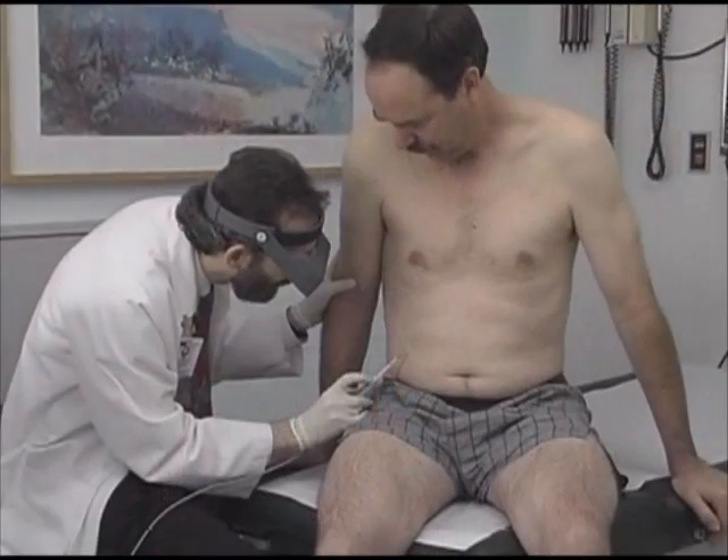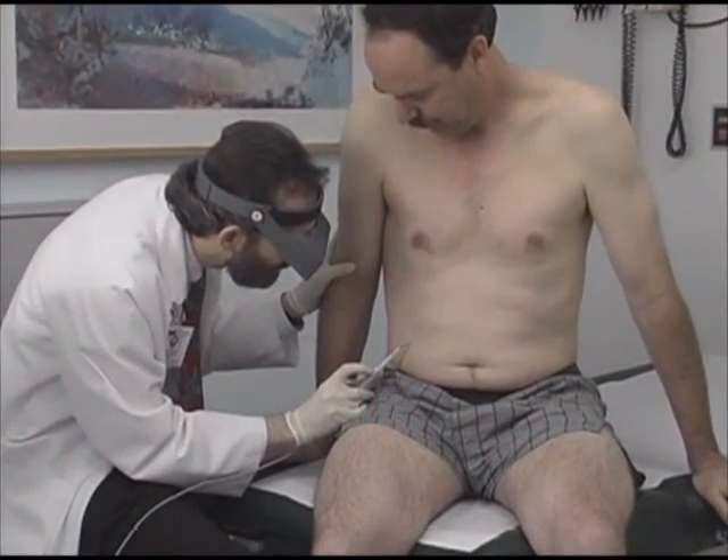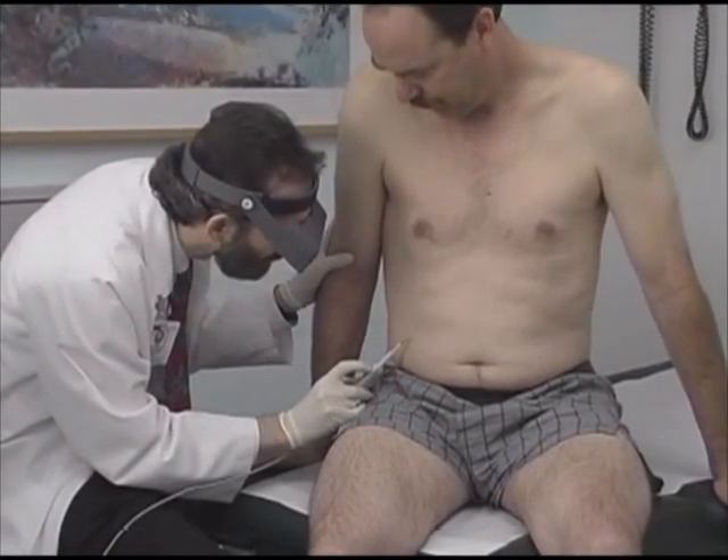Hi, I'm Dr. Richard Usatine, a family physician and lead author of Skin Surgery, a Practical Guide. During this program, I will cover the principles of electrosurgery and then demonstrate how to perform the most common office applications of electrosurgery.